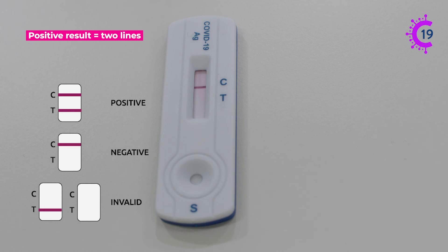If there is a positive test result there will also be a line visible at the T. Even if this line is very faint it means your test result is positive.